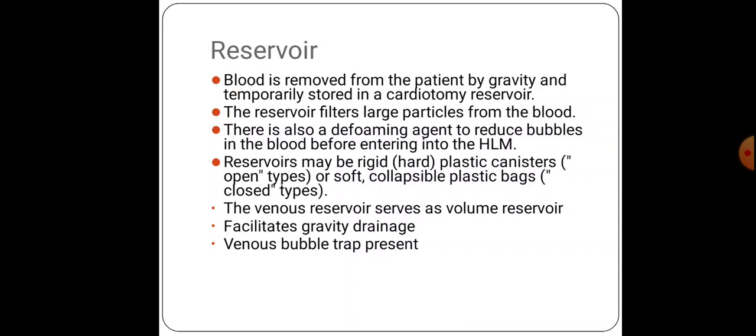So blood is removed from the patient by gravity and temporarily stored in the cardiotomy reservoir. Cardiotomy means there will be an opening in the heart, so that is called the cardiotomy reservoir. This reservoir filters the large particles from the blood. It also acts like a filter. There is also a defoaming agent.